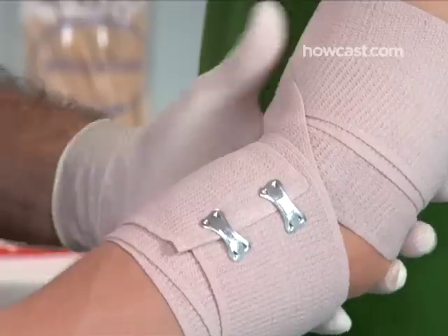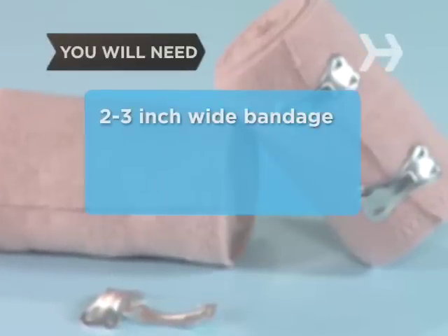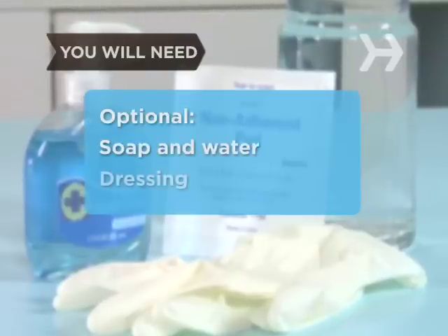It's also a pretty simple process. You will need a 2 to 3 inch wide bandage, binding clips or adhesive tape, soap and water, and dressing.